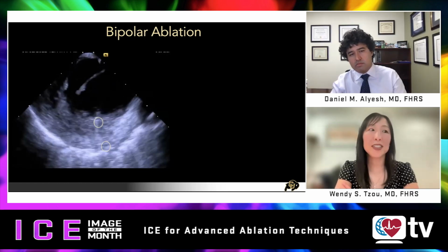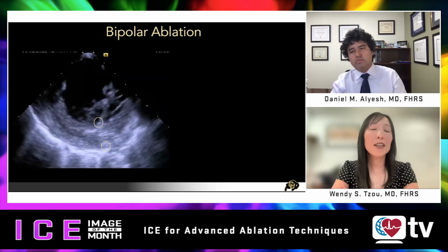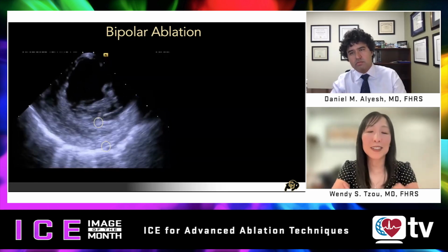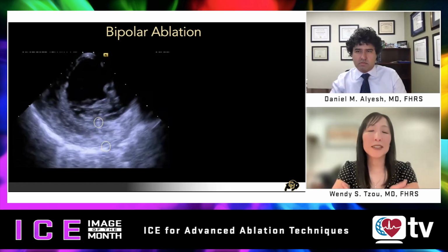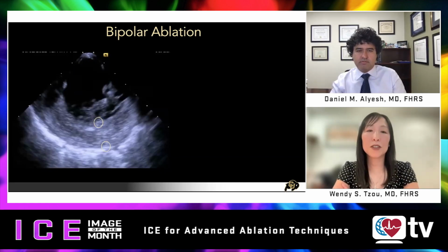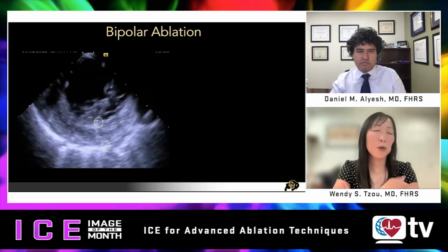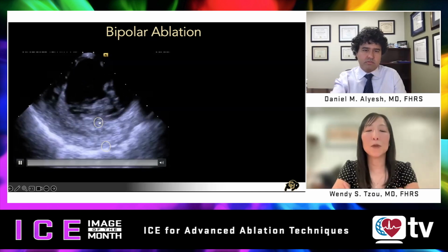And the good reason usually is that I think it's safe. So it's off the septum, a little bit more lateral, beyond that triangle that should be inaccessible. And also if I suspect it's a deep intramural source. So in this case, we've got an ablation catheter that's positioned on the LV endo, kind of close to, but a little bit more lateral to where the AMC would be.